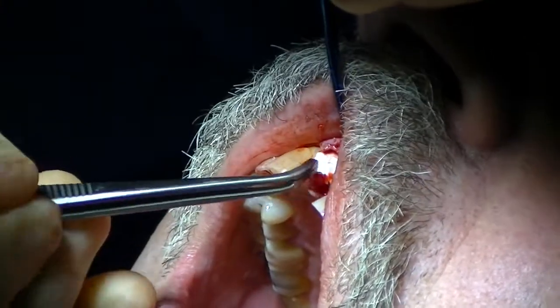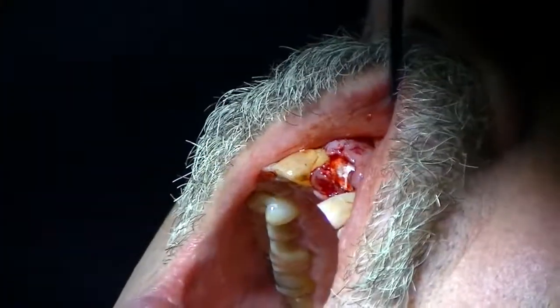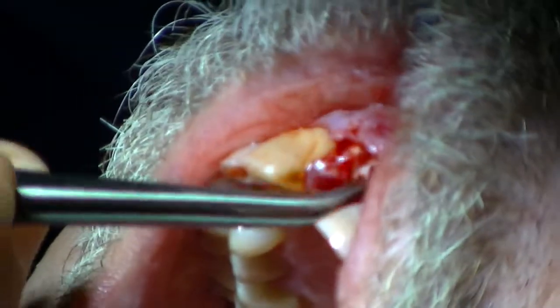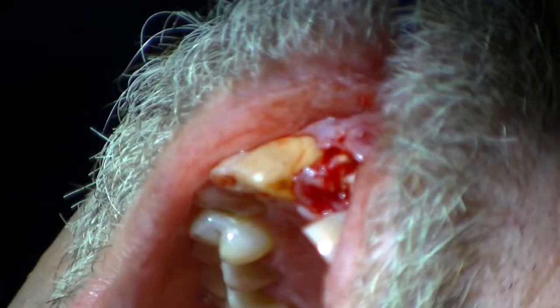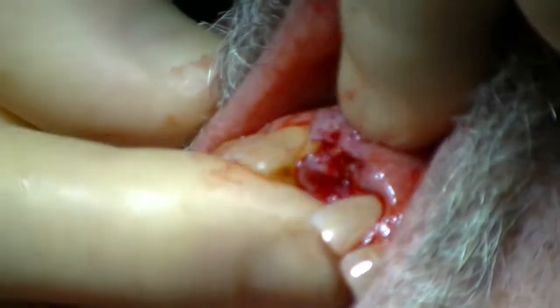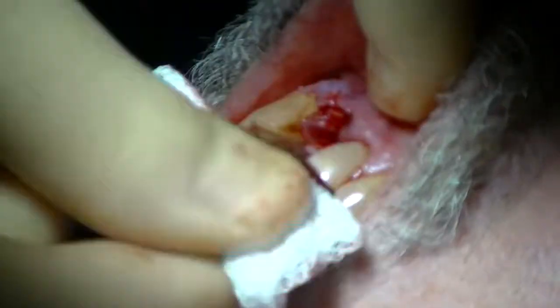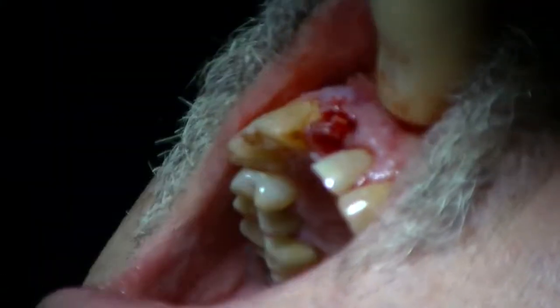It's not going to hurt to have this membrane there. Can you see how it's passive, doctors? There's no mystery here. There's no forcing, tugging, or anything like that. I'd give it a good squeeze, and you can see that I did not damage my interseptal bone. I maintained the facial plate of bone, and then let's just go through the surgical procedure.